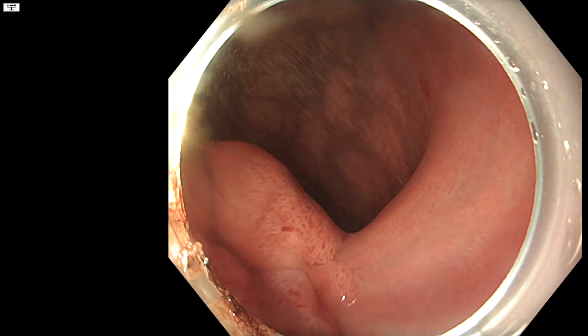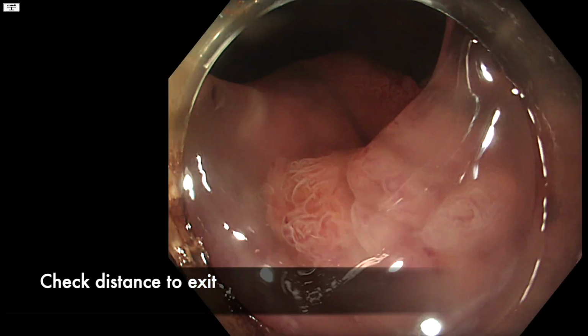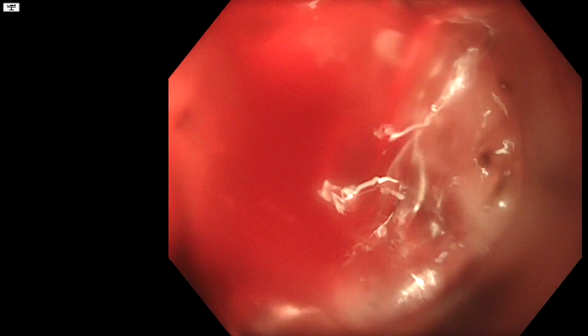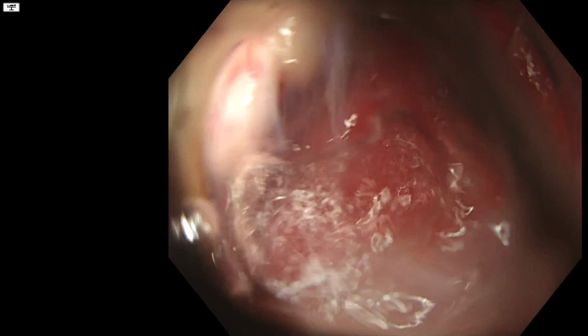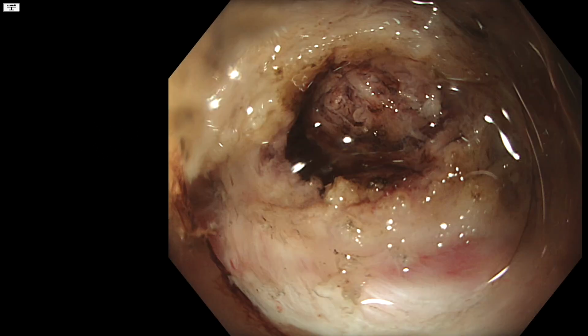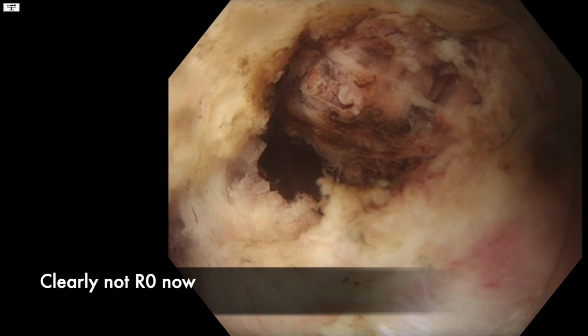Okay, so I'm now having second thoughts. I'm moving in and out to see the distance to the exit, which is actually surprisingly small, probably about 1.5 centimeters, and I think that's what kept me going. But again, as you will probably see here, with all this pressure and maneuvering, I've clearly ruptured through the specimen, so this is not an R0.